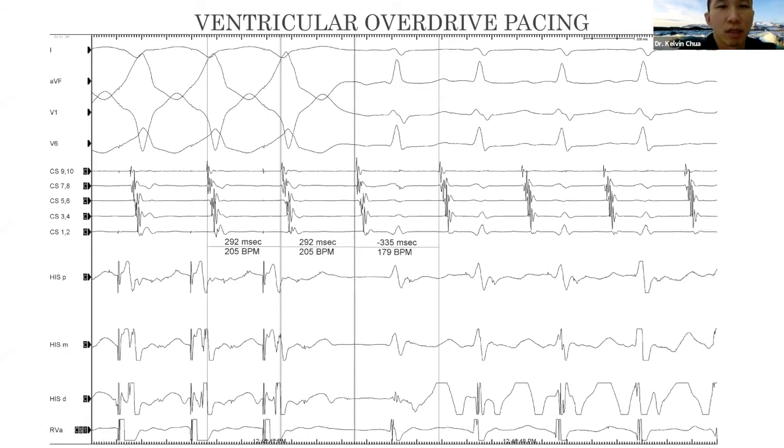So this is commonly what people would call a VAAV response, but if you see that it belongs to the last pacing stimulus, this is a pseudo VAAV response. I think that's what Ms. Liang is trying to show. Maybe you want to explain a little bit more? Yeah, those who polled for atrial tachy, if they didn't measure just by looking at the response, might have concluded that it really is atrial tachycardia. So I'm really trying to emphasize, we really have to make sure the AA is the same as your pacing interval whenever you do this maneuver.